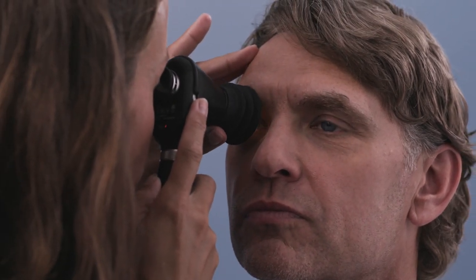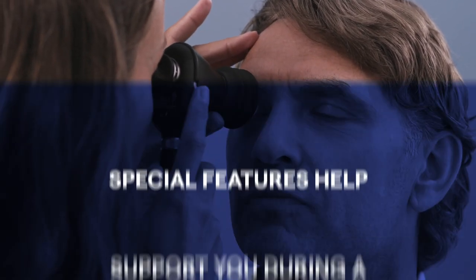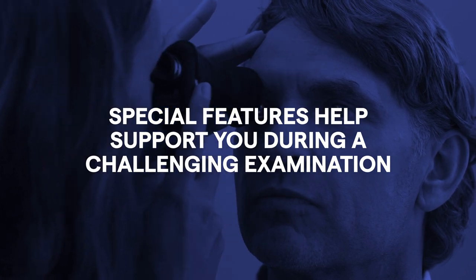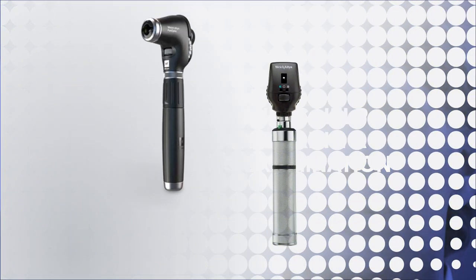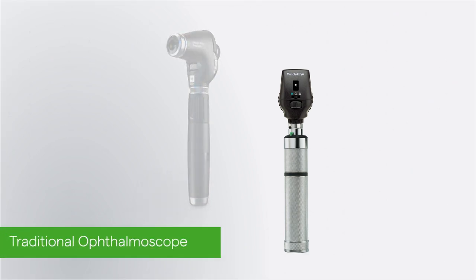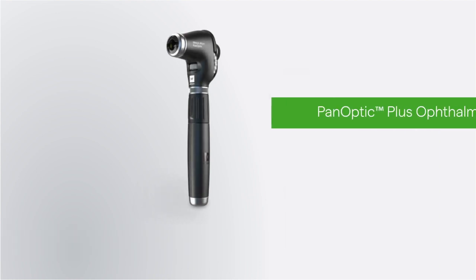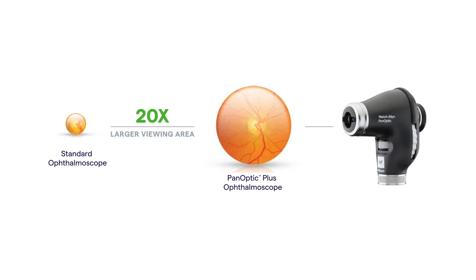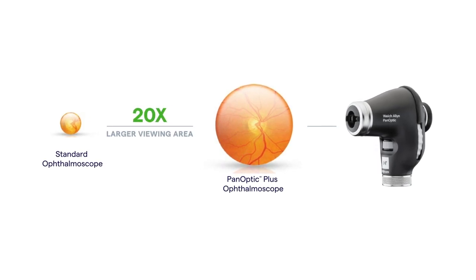When performing an eye exam, the basic steps are the same for most ophthalmoscopes. Special features on each ophthalmoscope help support you during a challenging eye examination. Hillrom manufactures two types of Welsh Allen ophthalmoscopes: a traditional ophthalmoscope and the WideView Welsh Allen Panoptic Plus ophthalmoscope, designed to give you a 20 times larger viewing area to help support faster and easier eye exams.